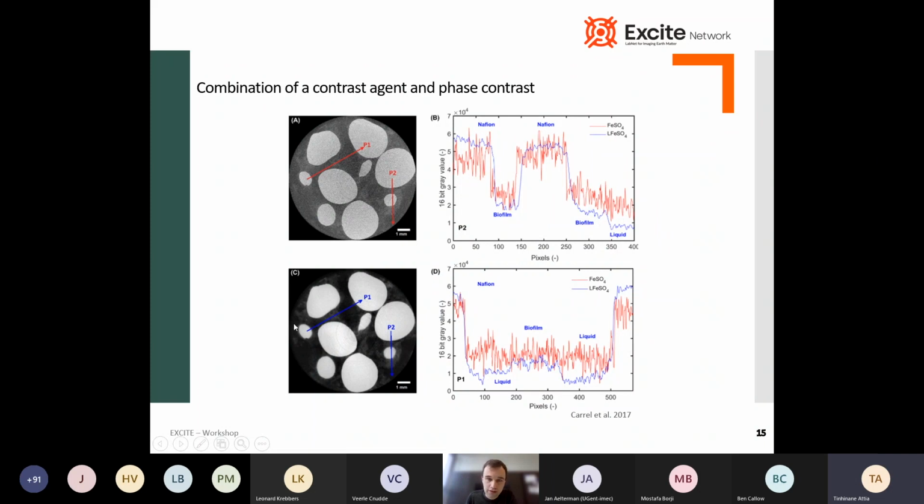However, when you use phase contrast by increasing the distance and some extra filtering, you can better see the different phases. This is also shown by the curves you can see on the right, which show the gray values. Like the red one on the top, which is P2, here it's very hard to distinguish biofilm from the liquid, from surrounding water. But when you use phase contrast, the difference becomes much more visible.